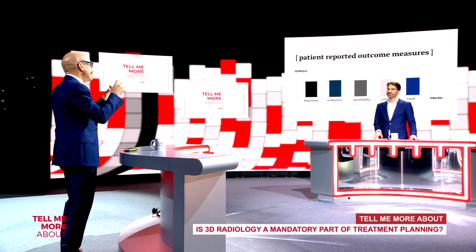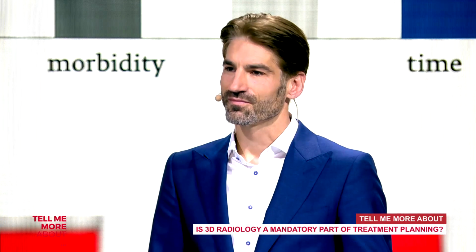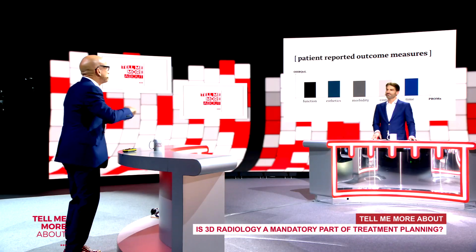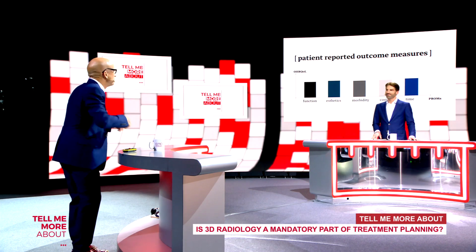Why? You know why? Because today, when I place an implant in the area, I have a lot to think as a surgeon. How do I manage at the end the soft tissue and the bony situation the right way? Where to place the implant shoulder? How to have at the end after surgery the perfect soft tissue around this implant? And this is not easy. Surgery around implants, even in the functional area, it's not just a cut in the middle, open the flap, place the implant, close the flap back, and that's it.